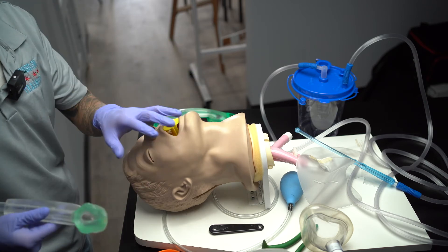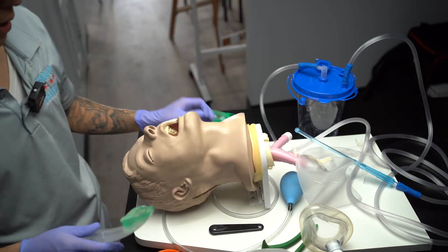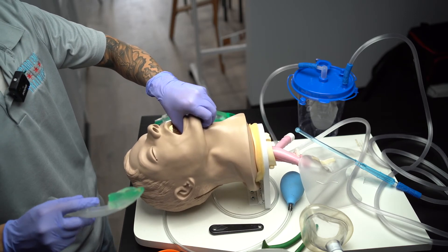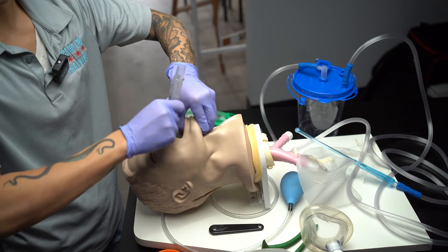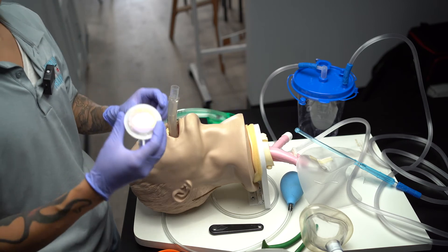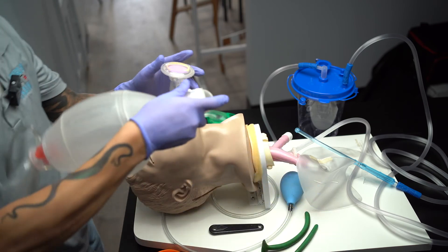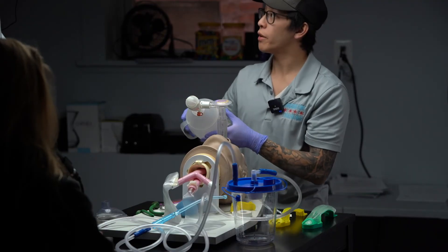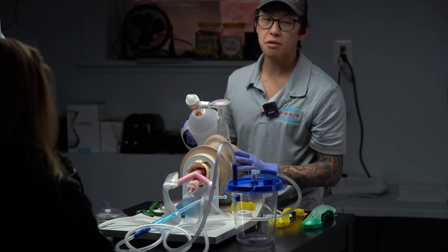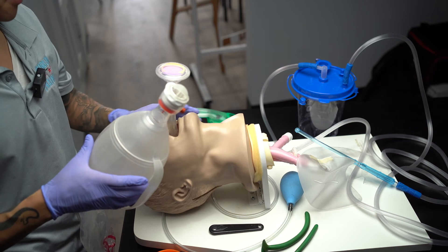I'm ready. I'm going to tell my partner to stop ventilating. They're going to remove the OPA, and I will be providing a tongue-jaw lift, making way for the i-gel. I'm going to insert the i-gel until I meet resistance. Once I've met resistance, I'm going to apply the colorimetric device, then apply my BVM on top of that. I'm going to continue ventilating one breath over one second every five to six seconds.